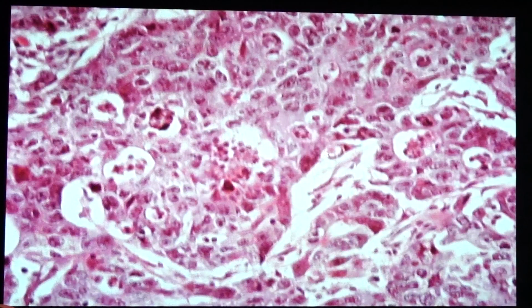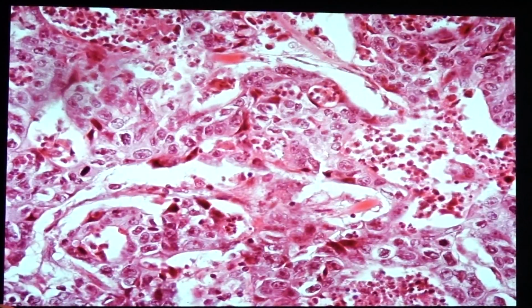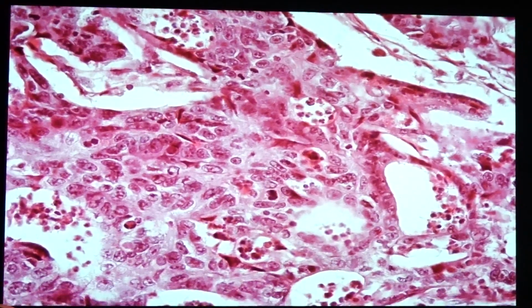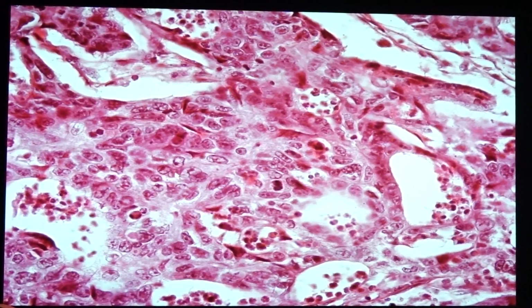This portion is already a nest, because you do not see the presence of the glandular pattern. What you would see would be a solid aggregate of atypical cells. Here, this one is also a nest, wherein you see the presence of solid aggregates of atypical cells, absence of glands within them.